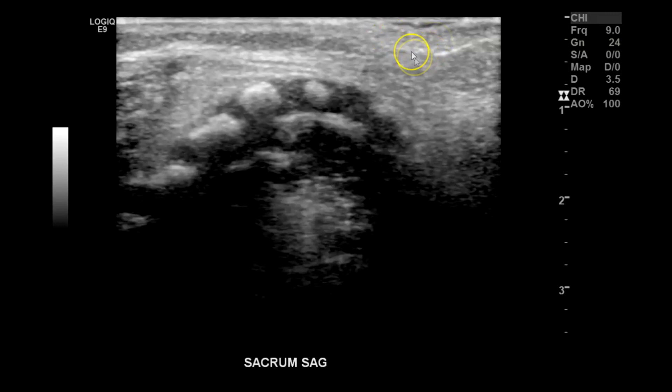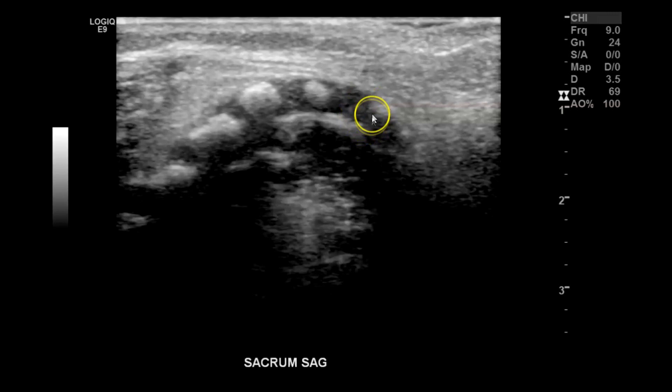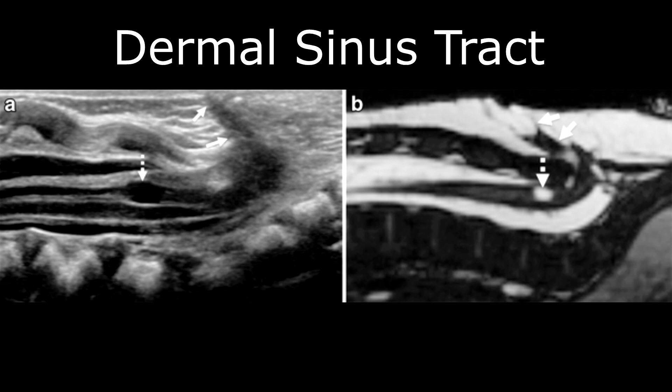The majority of these exams are done for sacral dimples. I begin in the sacrum, in the intergluteal cleft, and try to get the end of the sacrum. This looks like the coccyx, but this is actually the fifth sacral element. The coccyx is usually here; with a higher megahertz transducer you should be able to see it. If they're newborns, it might not be ossified at all — it might just look like cartilage. Make sure there's no dermal sinus, meaning any tracks leading from the skin surface to the spine.